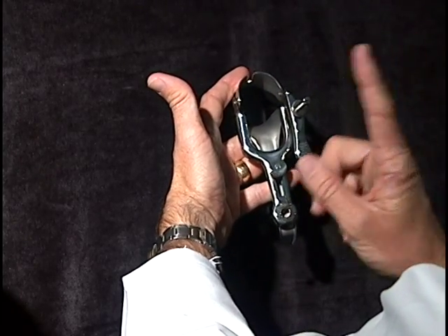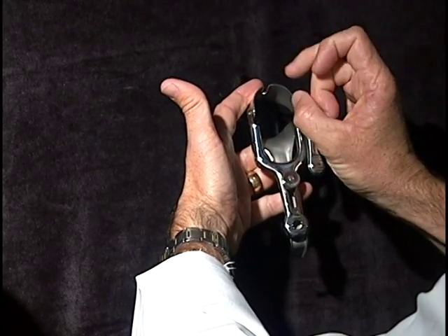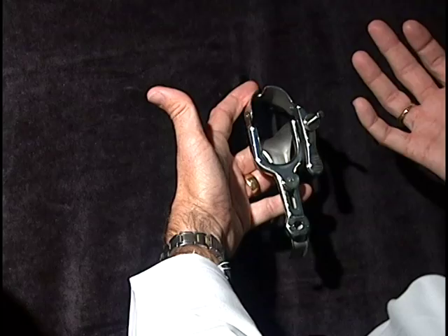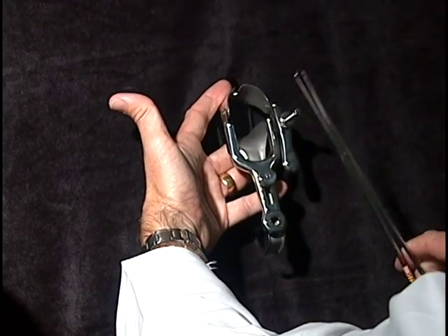The cervix only has one job: to stay closed until the mom gets to term, at which point the cervix would start to open and the baby would be delivered. So in order for the first trimester abortion to be performed, first the cervix has to be seen with the speculum, and then the cervix needs to be stabilized and grabbed.